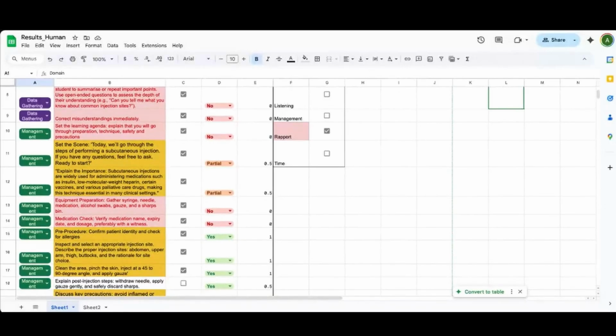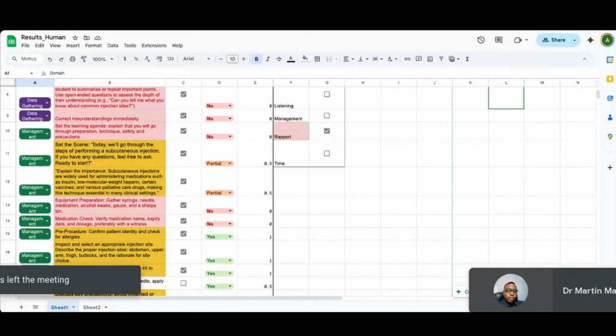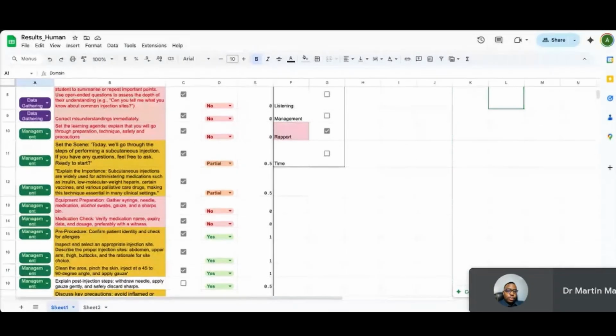So you're looking for areas where the subcutaneous fat is high, right? So this is like a slow modified release. It's not like an immediate uptake. It gets absorbed in the fat and then it slowly keeps releasing these medications.